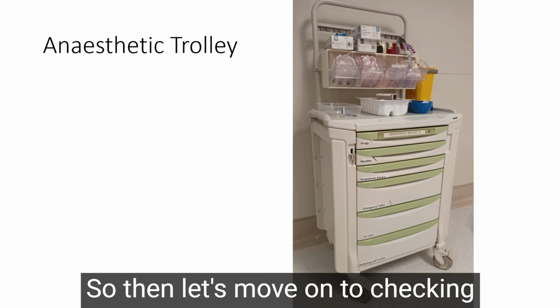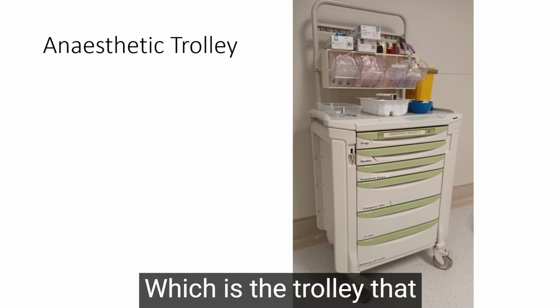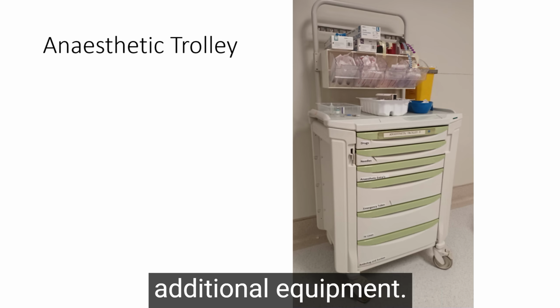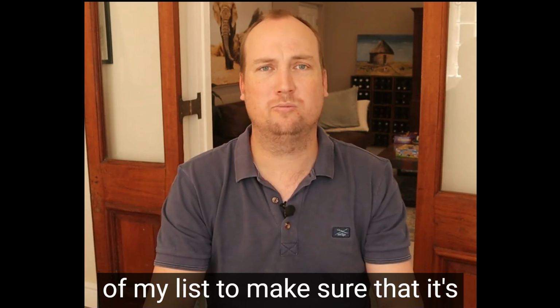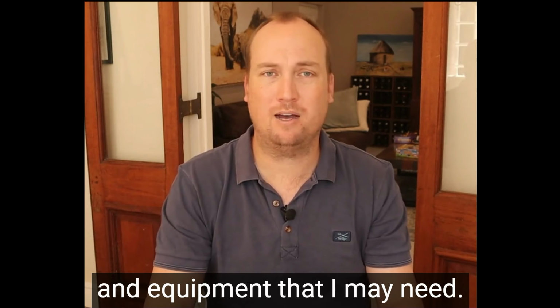Right, so then let's move on to checking the anesthetic trolley itself, which is the trolley that contains all the anesthetic drugs and syringes and additional equipment. I like to check the anesthetic trolley thoroughly at the beginning of my list to make sure that it's well stocked with all the drugs and equipment that I may need.